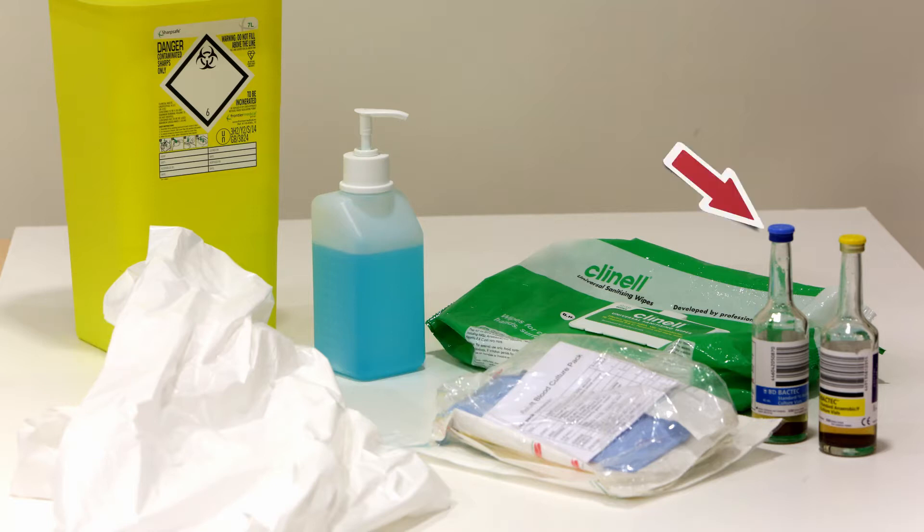A set of blood culture bottles usually consisting of an aerobic and anaerobic bottle, alcohol hand rub which can be found at the patient's bedside, clinical wipes, and a tourniquet.